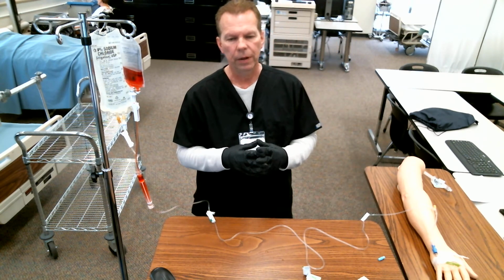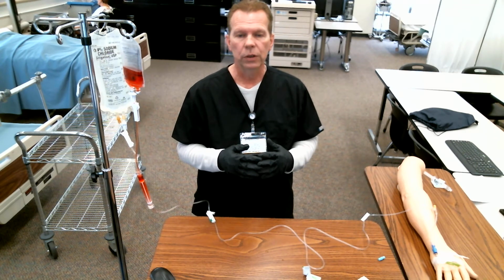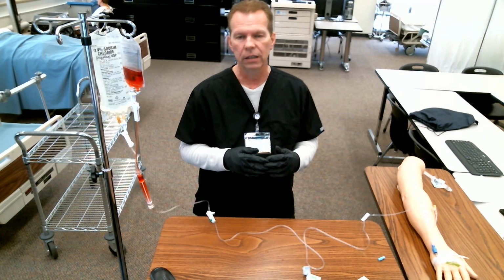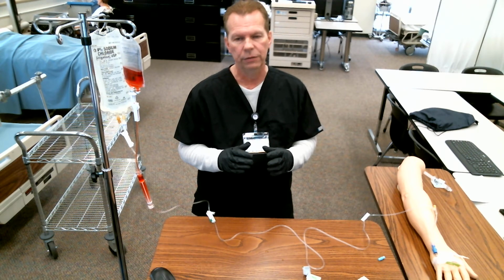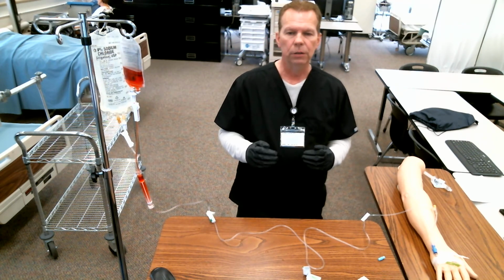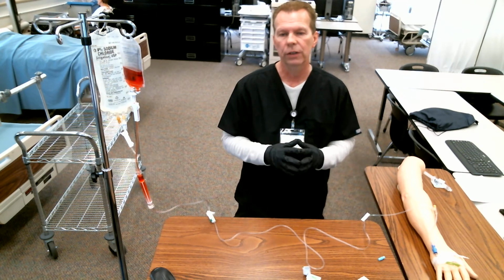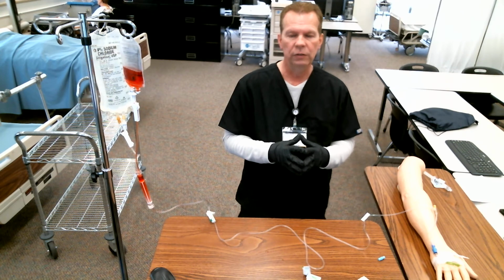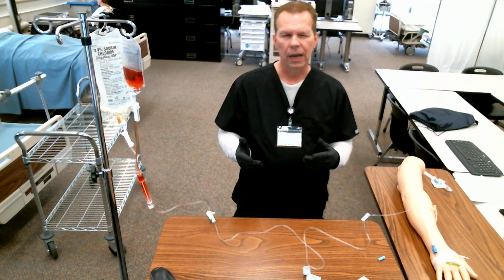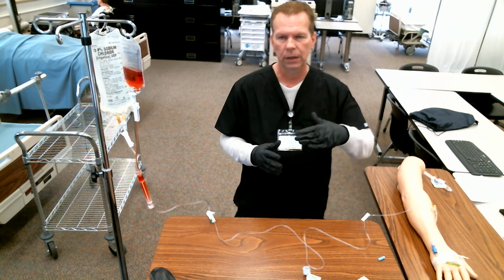So I'm going to start my pump, and I'm going to run it very, very slowly. The first 15 minutes, we're only going to run it about 50 cc's an hour. And so the patient's going to get very little bit of this blood in 15 minutes. And so what we're going to do is we're going to stay with the patient and monitor the patient for that first 15 minutes. So you cannot leave the room, you cannot leave your patient for that first 15 minutes. Set your pump to run at 50 cc's an hour and stay with the patient for 15 minutes. I think I calculated it once out, and I think that comes to 12 milliliters in that 15 minutes is all they're going to get.